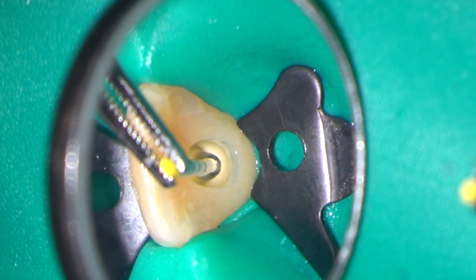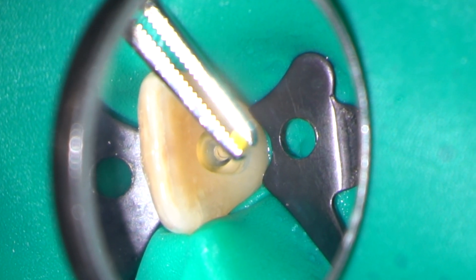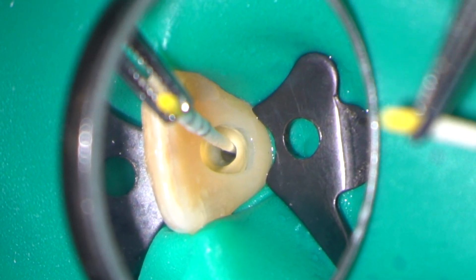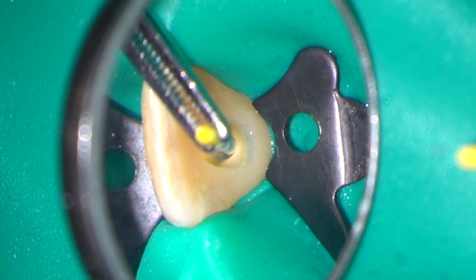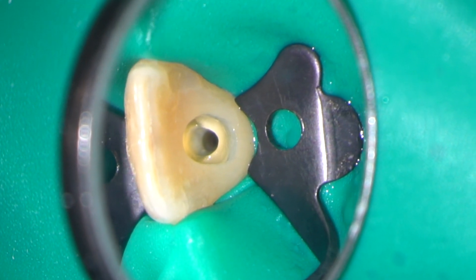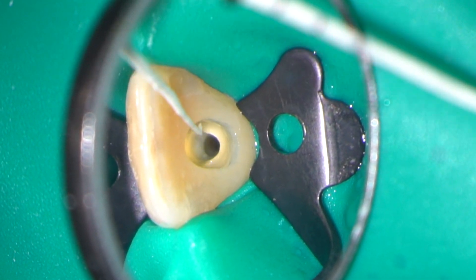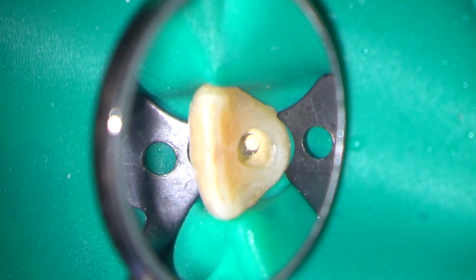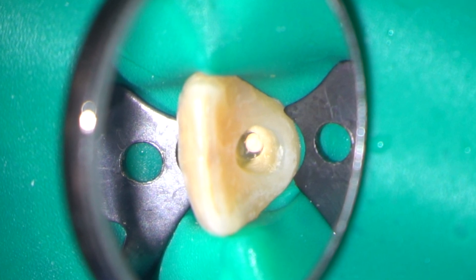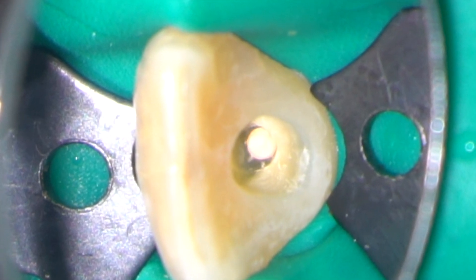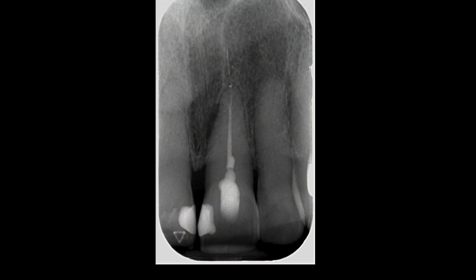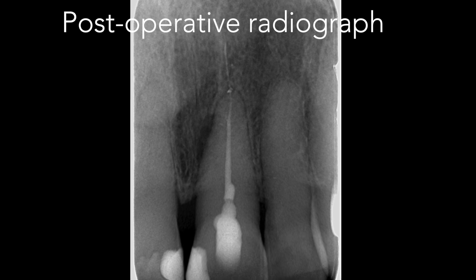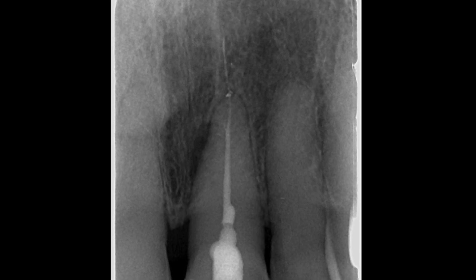Here the canal is being dried with matched paper points before being obturated using a vertically compacted gutta-percha technique. I'm pleased with the final result — there's a good apical-coronal seal and a little lateral canal pointing to the lateral radiolucency.